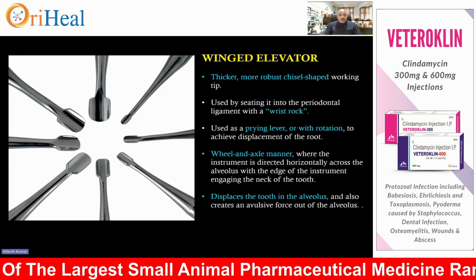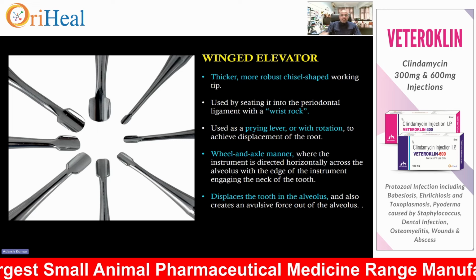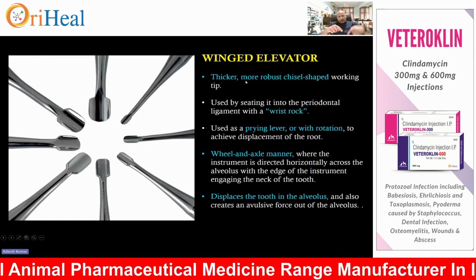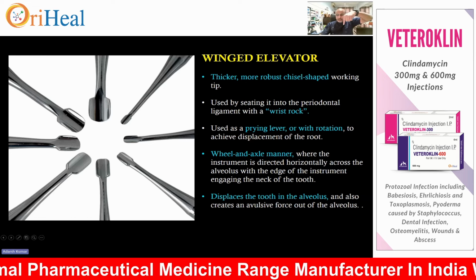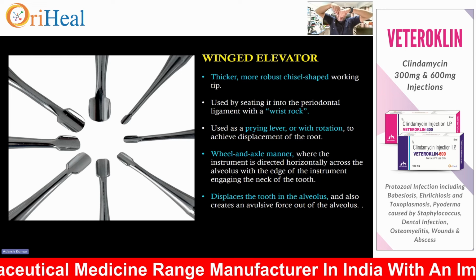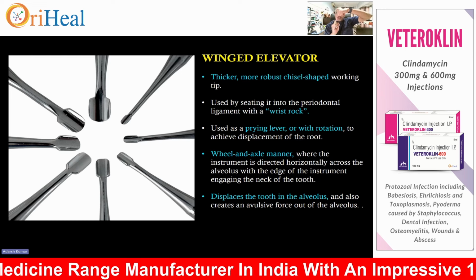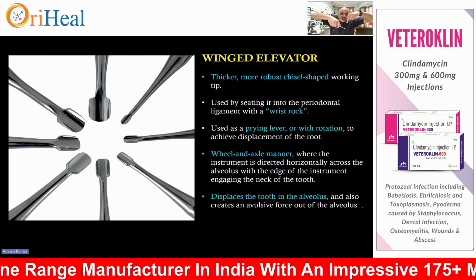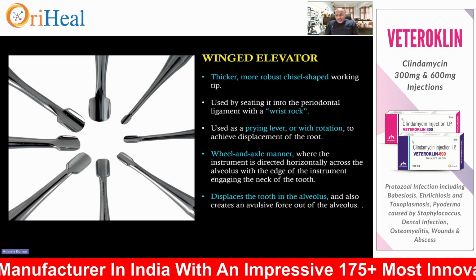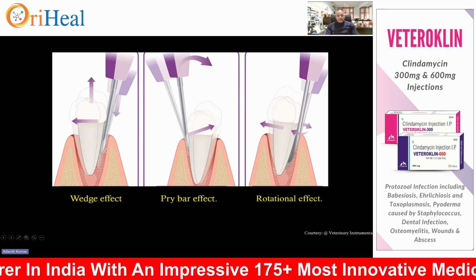Whenever you're doing a prying lever motion, you have to slightly rotate it. So once you start from one tooth, you can go like this, from here, from here, from here. So it becomes like a wheel and axle manner. So you go and try to create or elevate the tooth from the alveolar socket. Right. Now these are the movements here.